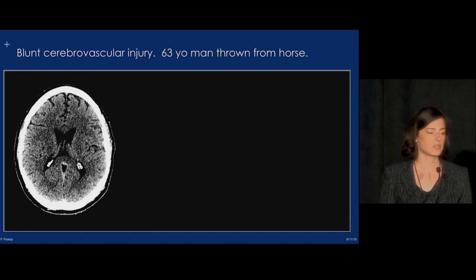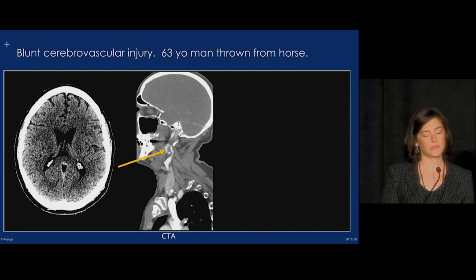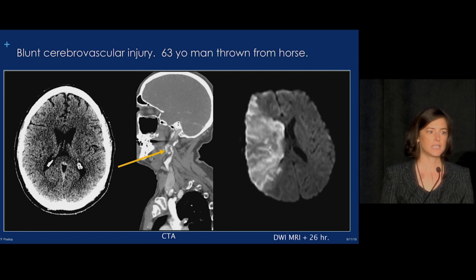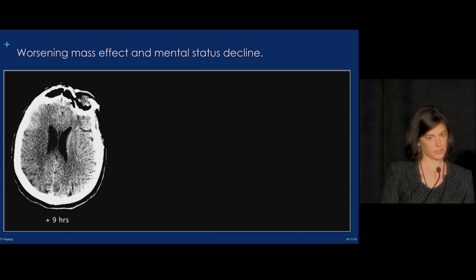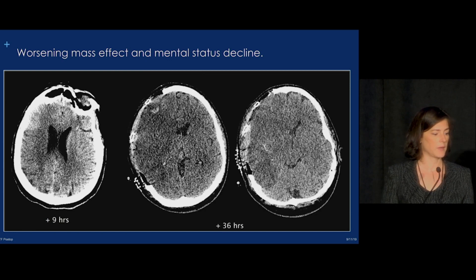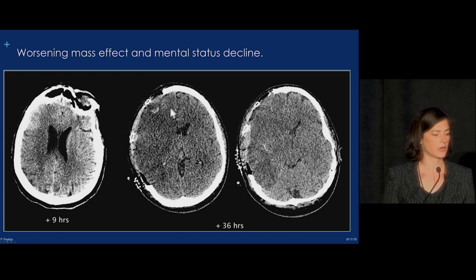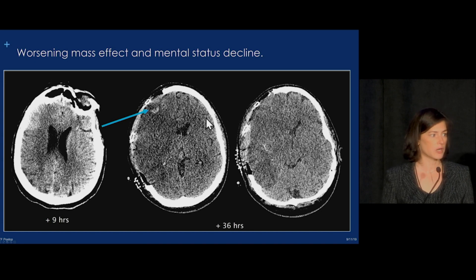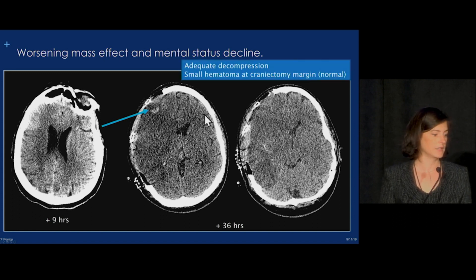Our next case is a patient who had a blunt cerebral vascular injury. His initial head CT was negative. He got a CTA, and we see a very good example of intraluminal thrombus, which was a sequela of a dissection. Unfortunately, he went on to develop a large infarct. His mass effect worsened to the point of mental status decline, and he underwent a decompressive hemicraniectomy. We can see a large craniectomy defect giving the brain lots of room, but there is still significant midline shift. Small hemorrhages at the margin of the craniectomy defect are common and not a complication as long as there's no associated mass effect.